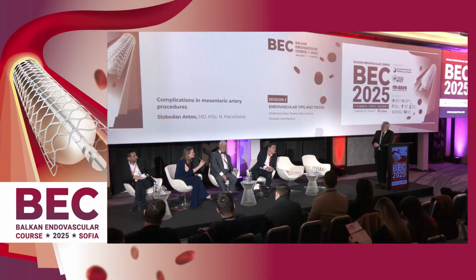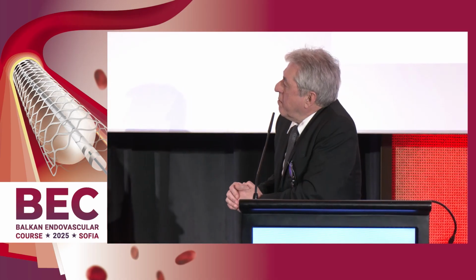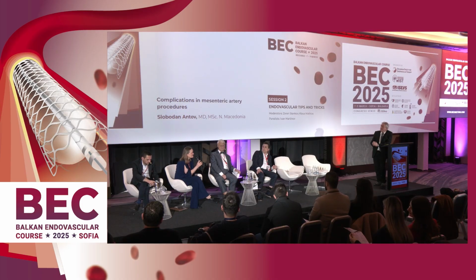It's better with C-Guard then. It's not a very big differentiation. It's not that all dual layer stents are the same. There is a big difference between the C-Guard with the membrane and the Roadsaver or Casper stent, as it's called. And which one would you use? In this scenario, 80%, no need for pre-dilatation, no need for post-dilatation, catch material toward the vessel wall, and not allow it to go downstream. I would choose between two different ones, either the C-Guard stent, although I do not like the delivery system needing a 6 French system for it.